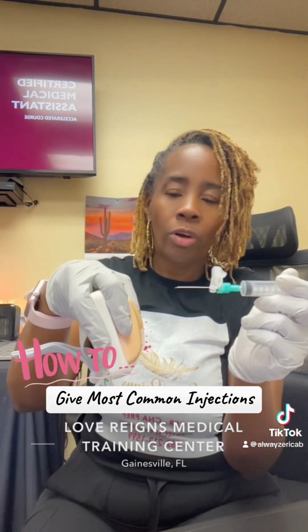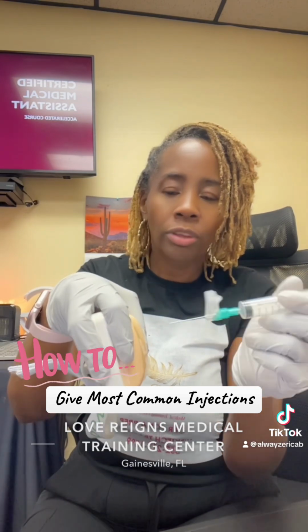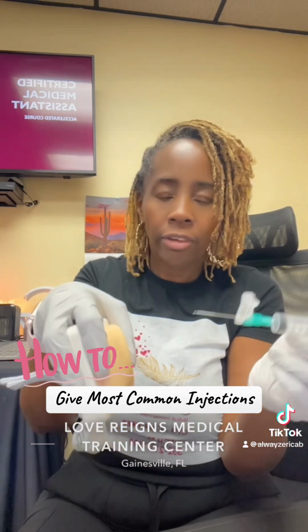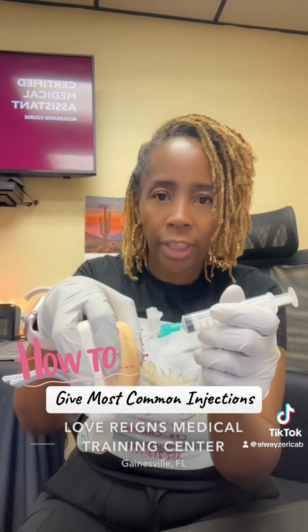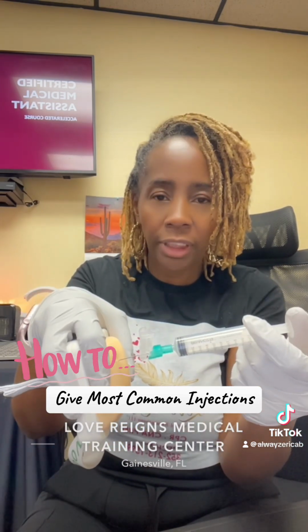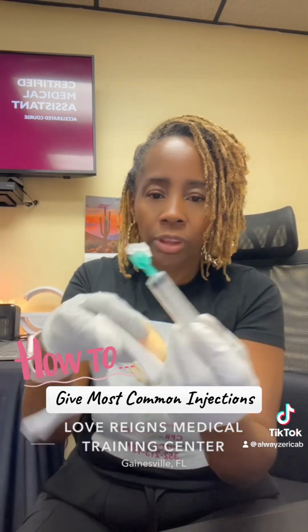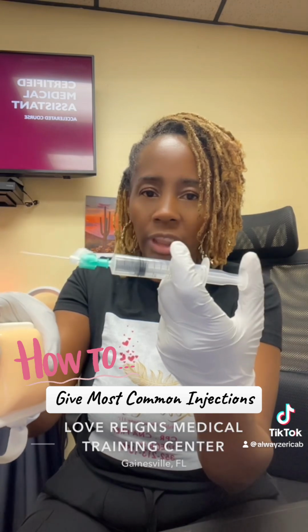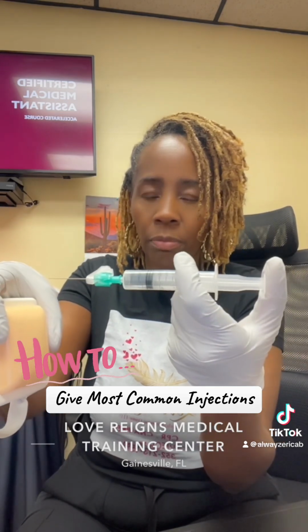But for the most part, we're going straight in like a dart. You don't need to go slow until you feel every tissue, okay? Literally 90-degree angle like a dart. And then we're going to push that medicine in, okay? Now, what I want you to know, too, is that people do this sometimes and it's going to cause a problem. People want to do this. You see how my finger's on the plunger?